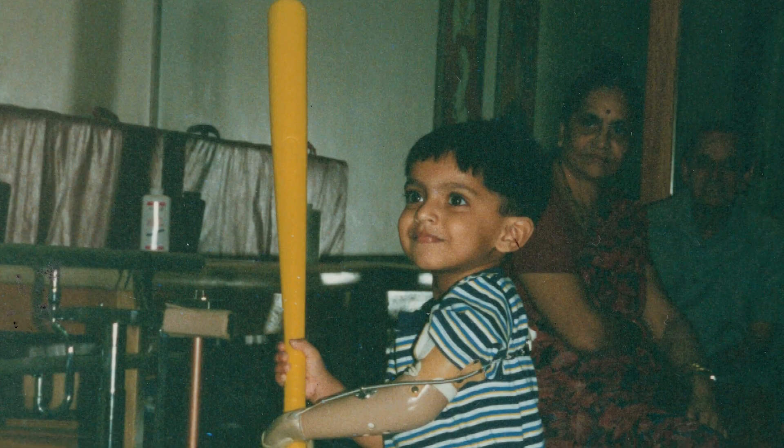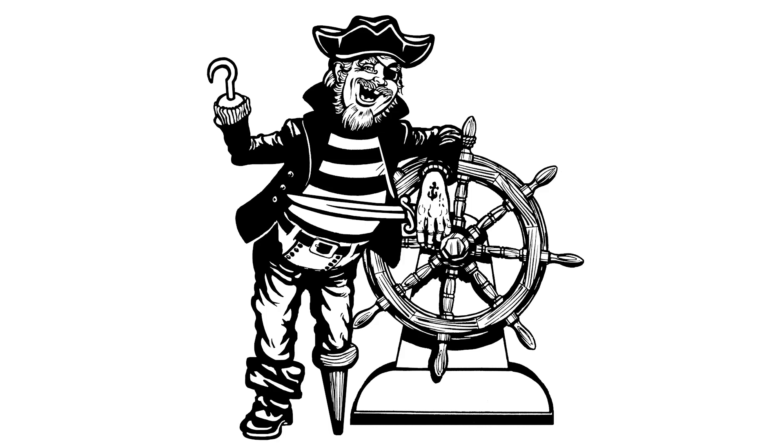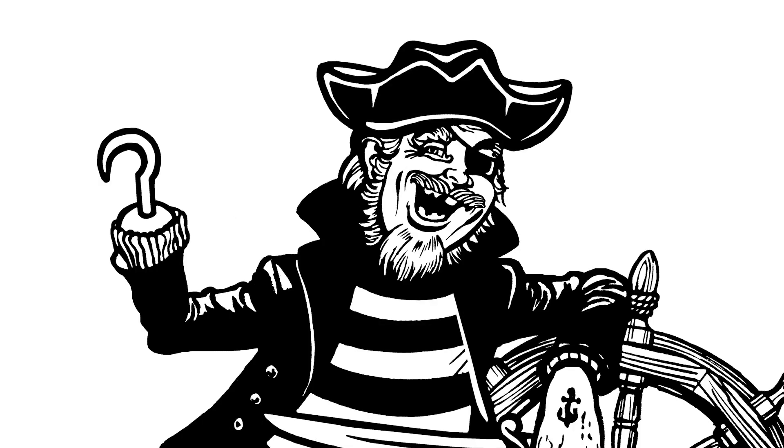I myself am a congenital amputee, which means I was born with one hand. In elementary school, I had a giant metal hook — it was just big, shiny, and silver, and it opened like this; it was basically a giant pirate hook like Captain Hook wears. As I grew older, I definitely found myself being a lot more shy about it.